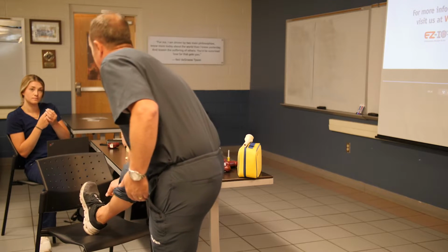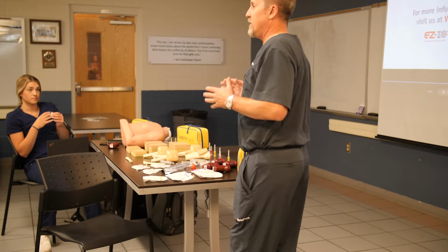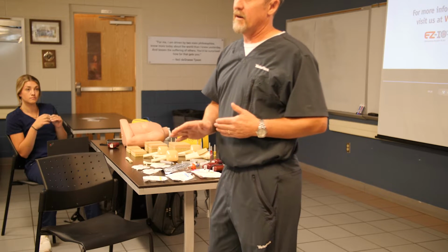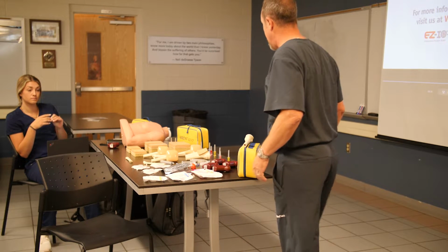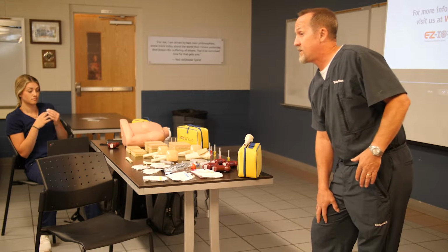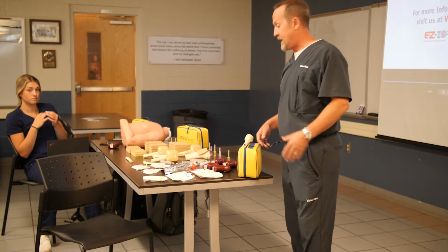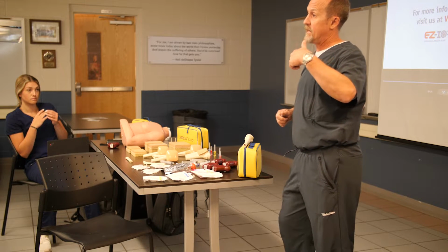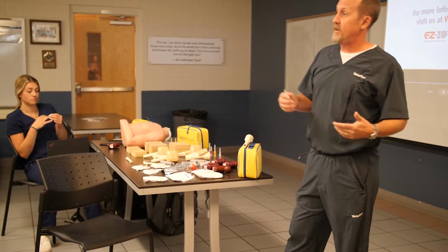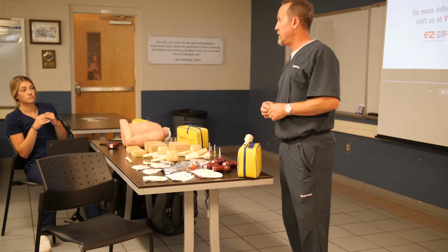As I mentioned, pediatrics we consider an IO 21 and younger. We try to keep this spot down in the femur for your patients that are going to be 15 or younger. Obviously that 9 and younger is going to be your prime target for that. And the reason for that is because as patients get bigger, their quadriceps, that soft tissue, is thicker. And you know, you get like a 17-year-old boy that's got big legs, even our longest needle may not be able to get through all that soft tissue and through the bone. So it's very, very patient specific, and you guys have to kind of use your judgment in the field, you know, when you're identifying how much soft tissue is there, okay?